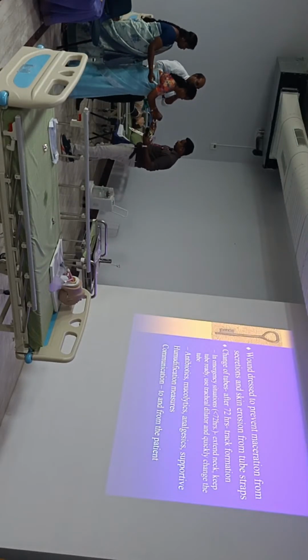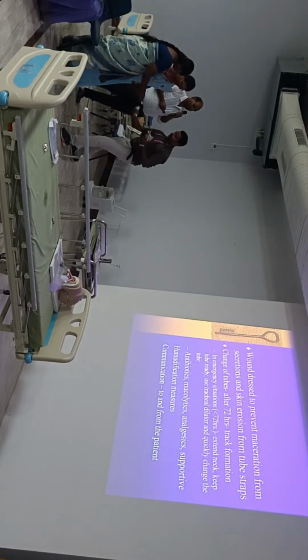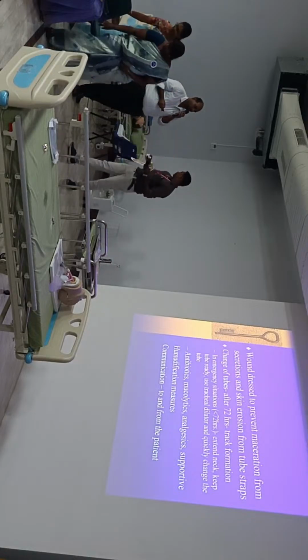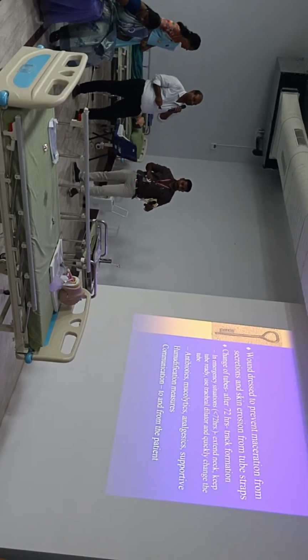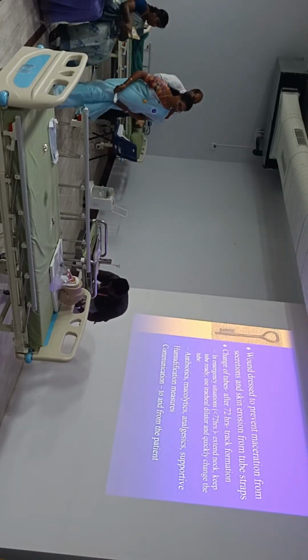So the other care would be related to the dressing. That is, you have to do a dressing mainly to make sure there are no infections, and then the secretions are reduced and there is no pressure necrosis related to the tube and the tapes.